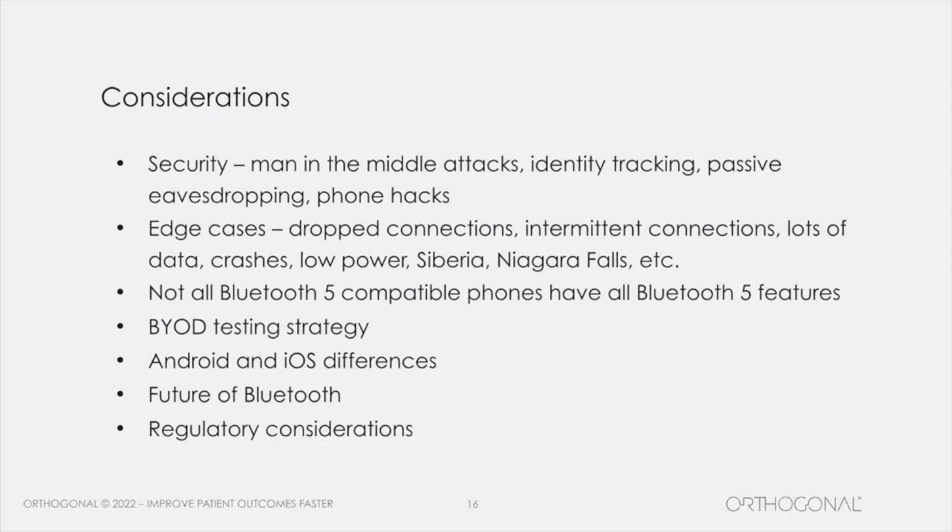And then again, because it's a consumer device and because of a lot of the different things that can happen, there are a lot of edge cases. Over time, we have built out a library of dozens, not quite 100, edge cases that we look at when we're looking at the different use cases and scenarios.